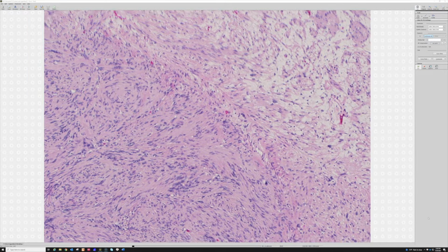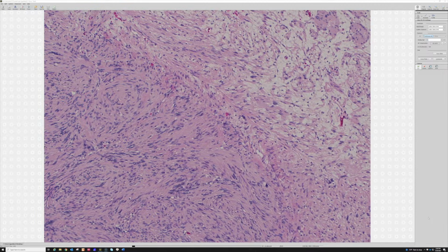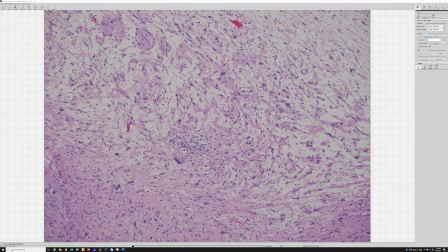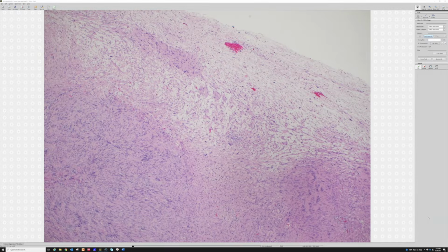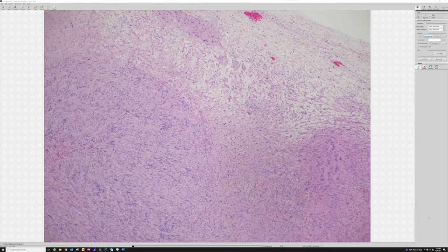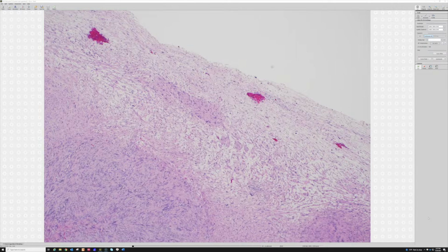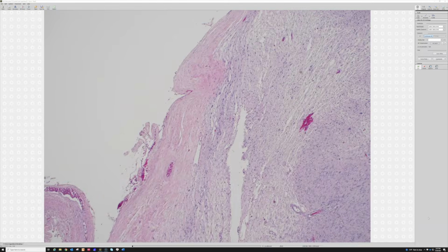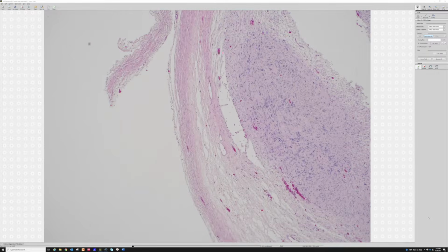And there they are. In all of pathology, but I think especially in derm path and also in soft tissue, the low power can give you some clues, right? Before we look at the cytology, we can look: is the whole thing homogeneous or is it heterogeneous? This is heterogeneous, right? We've got, like you said, cellular areas and then less cellular areas. Is it infiltrative or circumscribed? Well, this has a nice circumscribed appearance. Here, it's a little hard to tell where exactly we are.